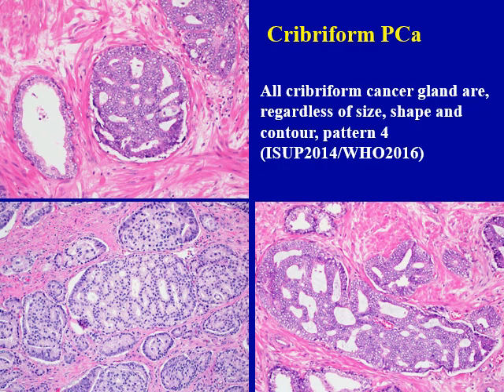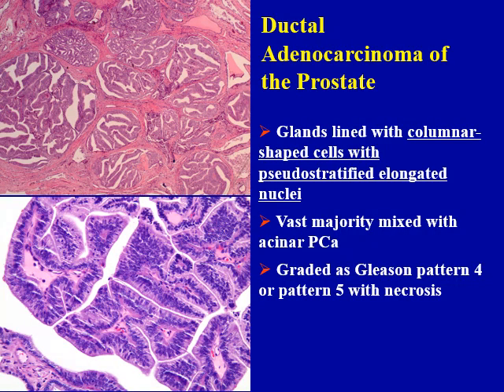Here are several examples of cribriform carcinoma of different size, shape, and contour. Remember, all cribriform carcinoma glands should be graded as pattern four. In ductal adenocarcinoma, I use very strict diagnostic criteria. Only when the cancer glands are lined with columnar-shaped cells with pseudostratified elongated nuclei will I make the diagnosis of ductal carcinoma. In the majority of cases, ductal carcinoma is actually mixed with conventional acinar carcinoma. It is graded as pattern four, or pattern five if necrosis is present.